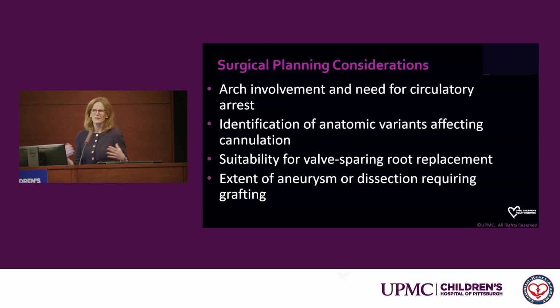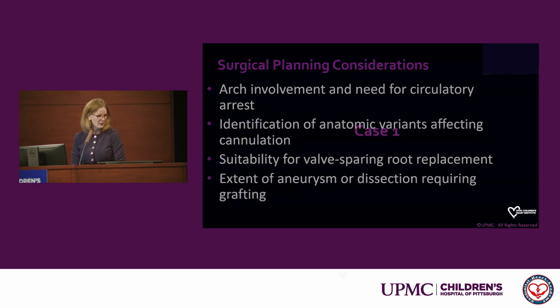And then there are other surgical planning considerations, other things you can get from CT, looking for little ASDs or VSDs, venous anomalies that might affect cannulation strategy. And then looking, for some of these cases, at how far up the arch a surgical treatment needs to carry from the valve.